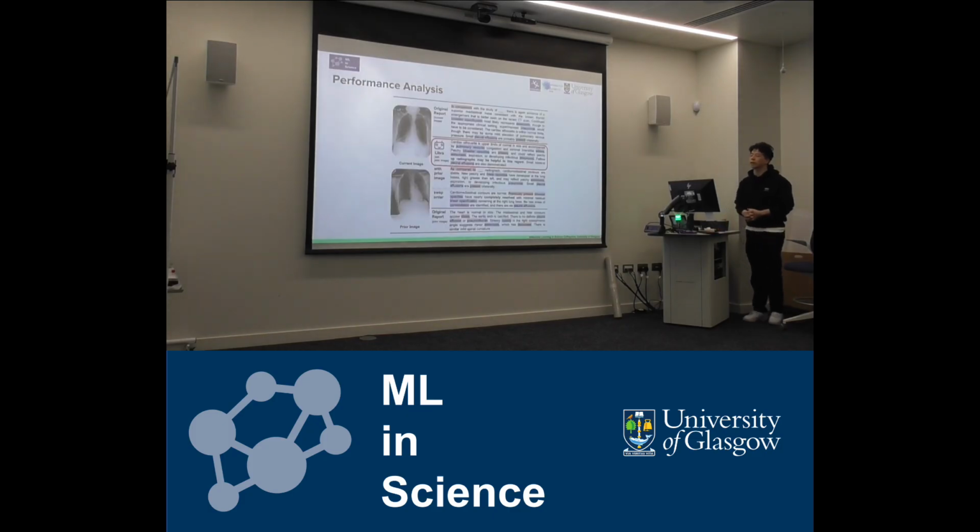That's why our model wasn't trained on that dataset. And here I think there are very interesting cases corresponding to the temporal hallucination type I mentioned before. The first is single image inference. Our model can generate the report based only on the current image, without any extra information, especially the temporal phrases like "as compared to". We don't have that information.